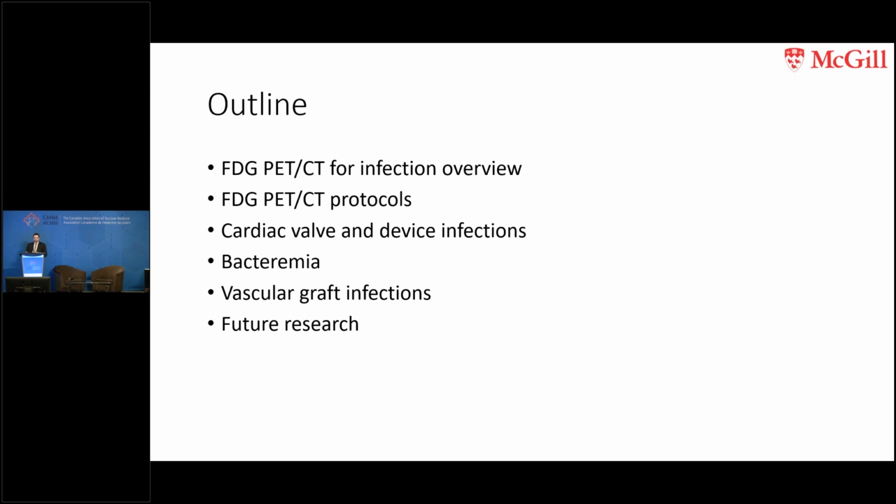So we're going to briefly talk about FDG for infection principles, the protocols that we have to use for imaging cardiac infections, and different types of cardiovascular infections.